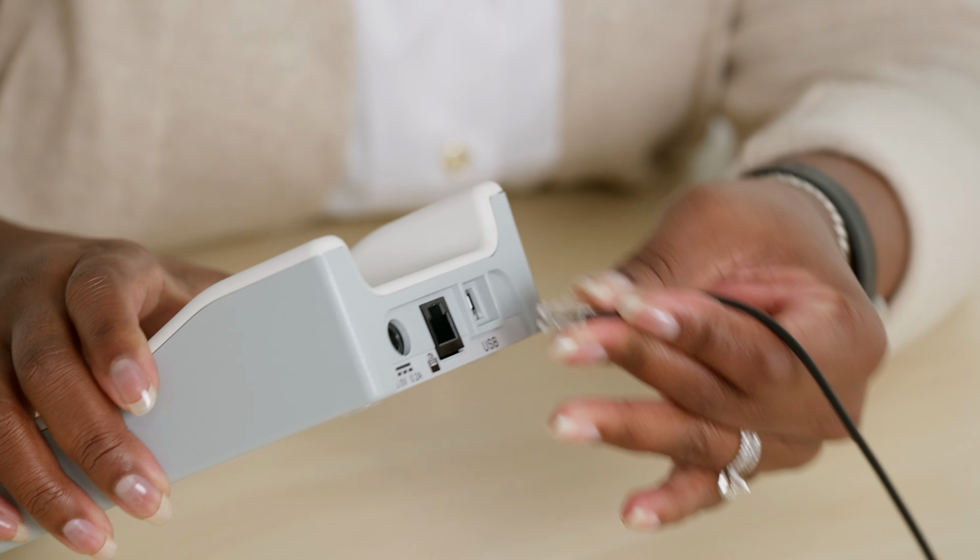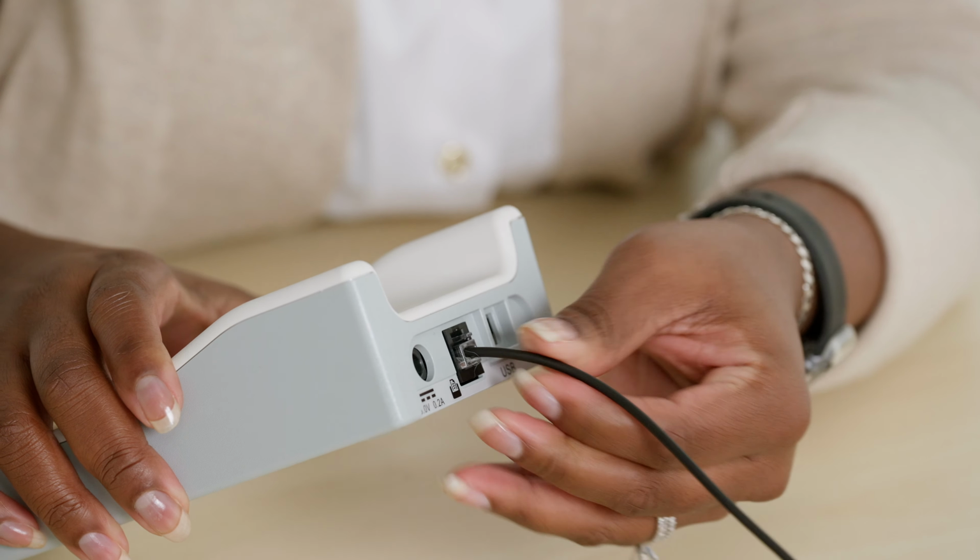Test results should be saved to the internal database or printed to ensure that data is not lost. Before attempting to print, ensure that the printer is fully charged, switched on, loaded with paper, and physically connected to the cradle with the printer serial cable. Place the Allegro into the cradle when you are ready to print.